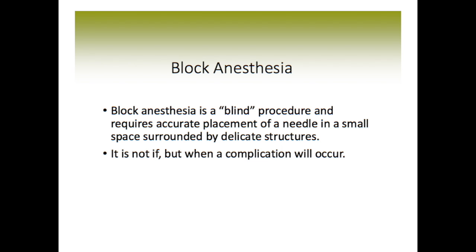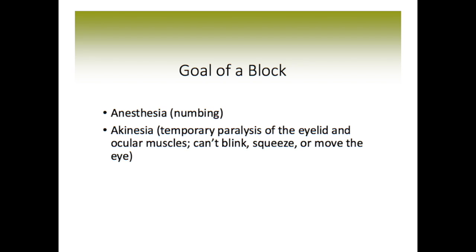You see, with the block anesthesia, it's a blind procedure. The needle is injected into the socket, and it requires very accurate placement of that needle, and it's in a small space surrounded by delicate structures like nerves and blood vessels. So it's not a matter of if, but it's a matter of when a complication will occur from a block.